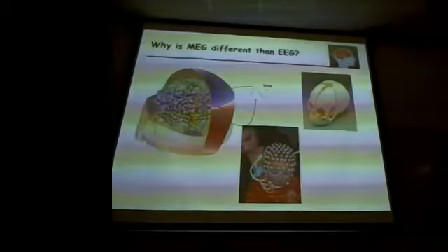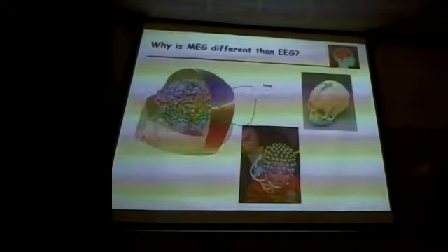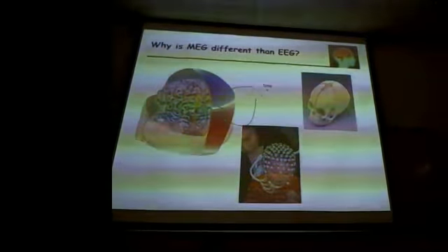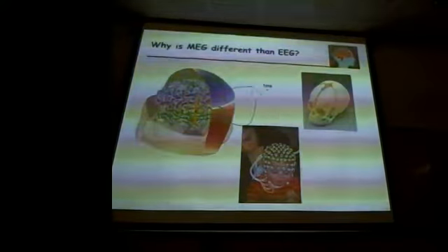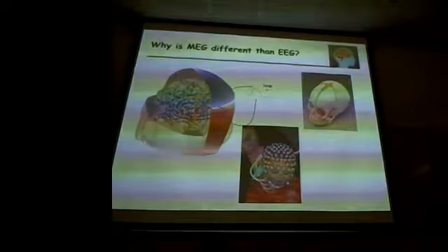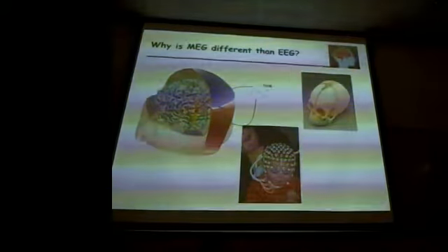The other primary difference between MEG and EEG is that with EEG you have to get the sensors to have a good electrical connection with the scalp. There are various ways that you can do that. This is one of the easier ways. This one uses saline solution. We all know that water is a good conductor. Of course, you have to make sure that there isn't water flowing between these sensors, otherwise you bridge sensors before measuring any actual brain activity.